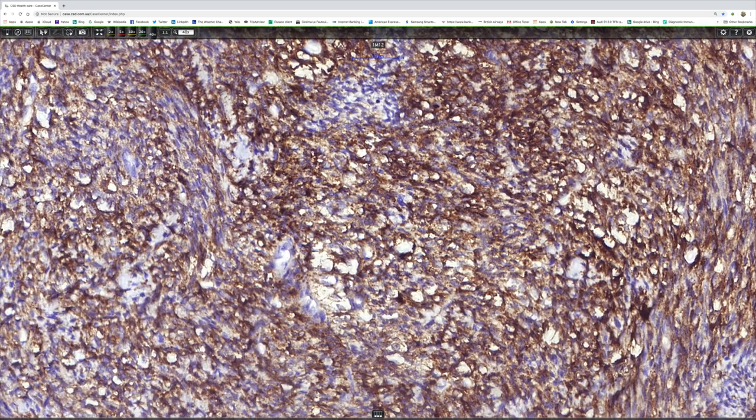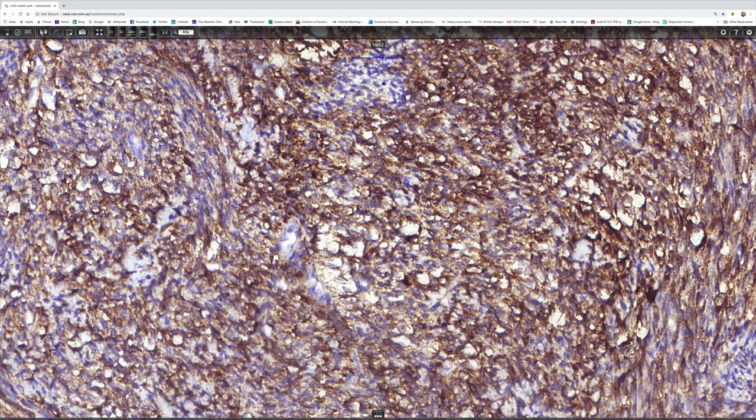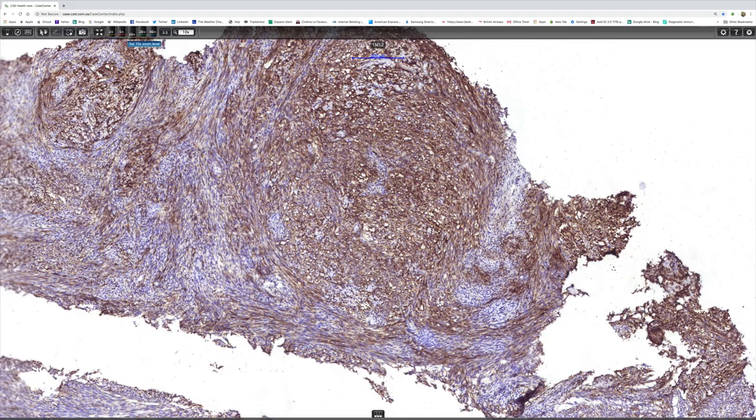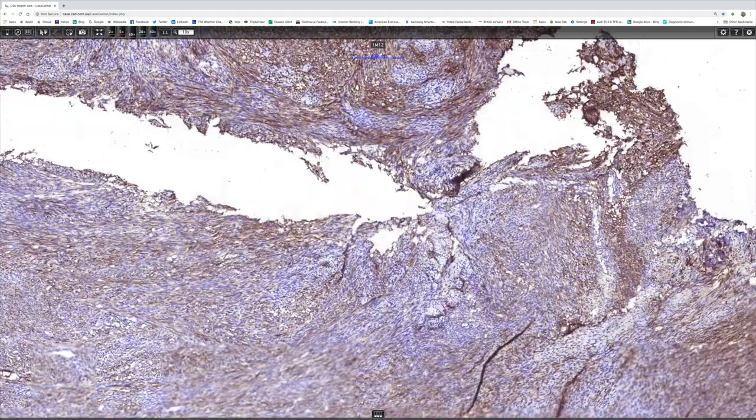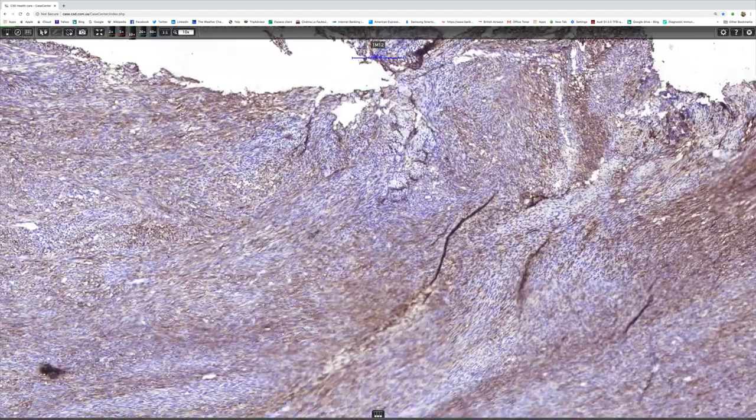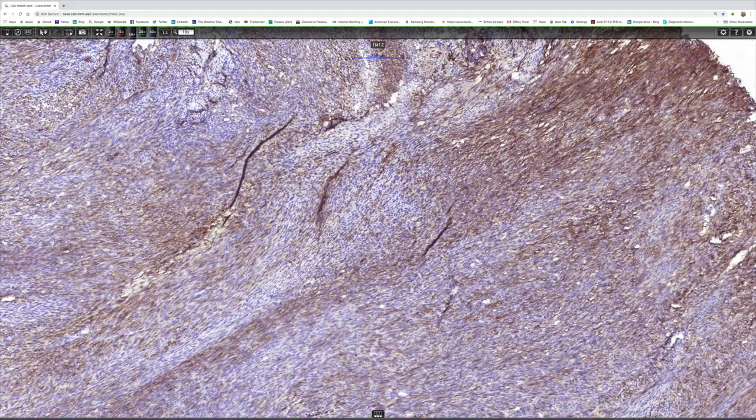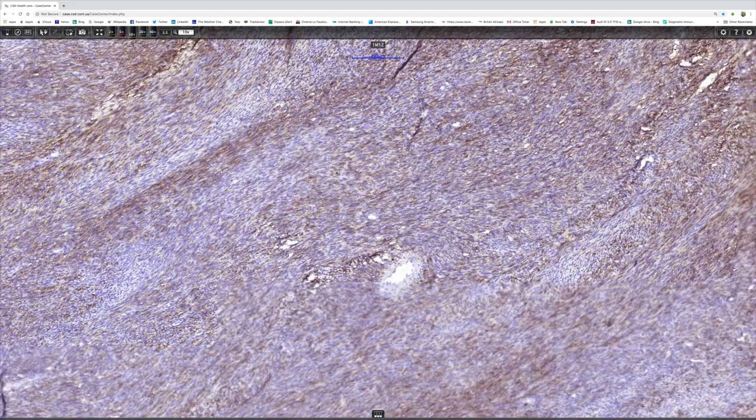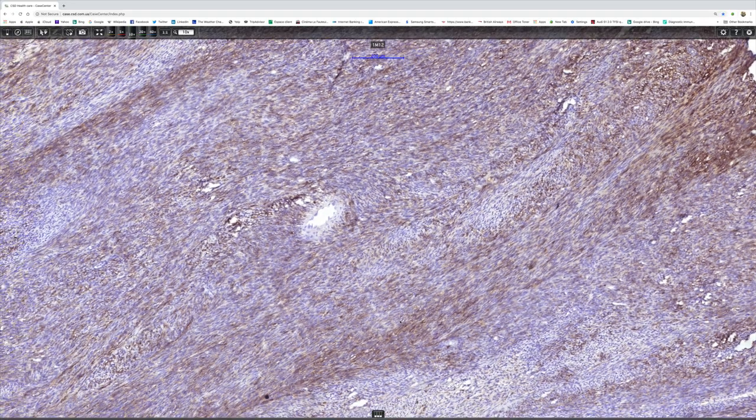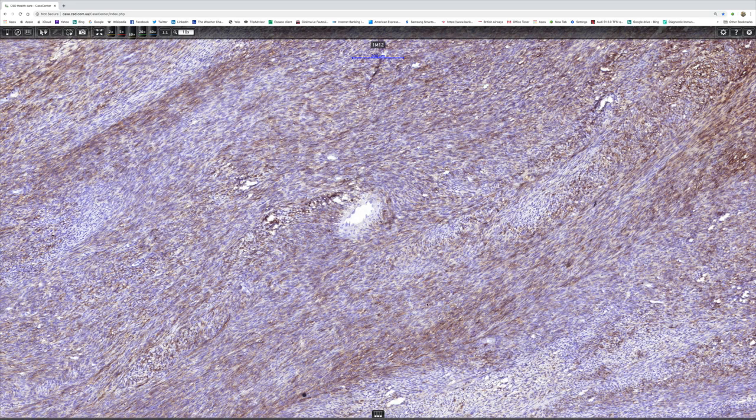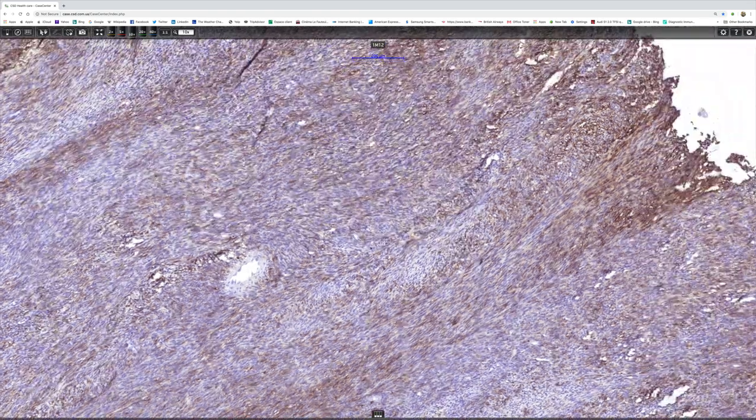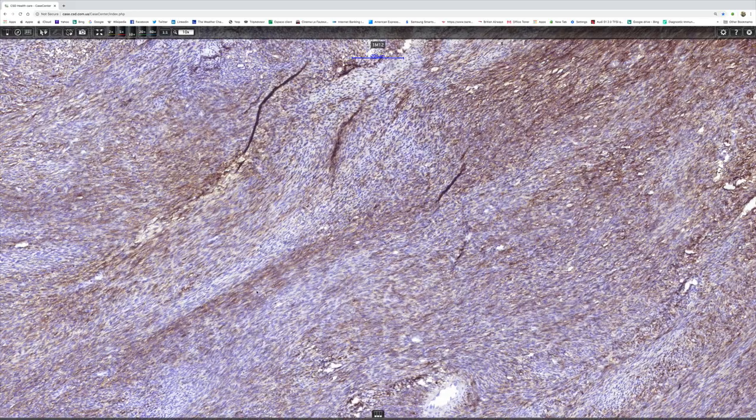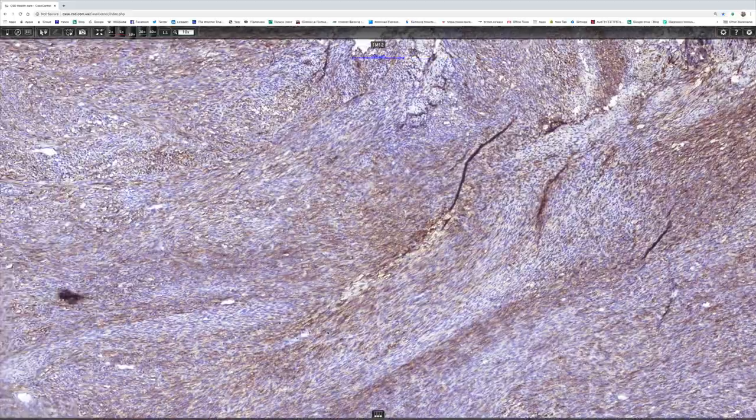If we come away from there and just scan around the rest of the slide, you can see there's a lot of EMA expression, but it's not uniform. Not every cell is expressing it, but an awful lot of them are, so I think we can regard that as bona fide EMA expression.